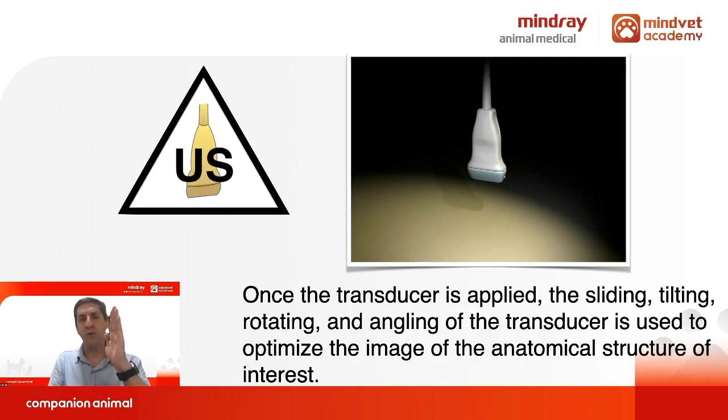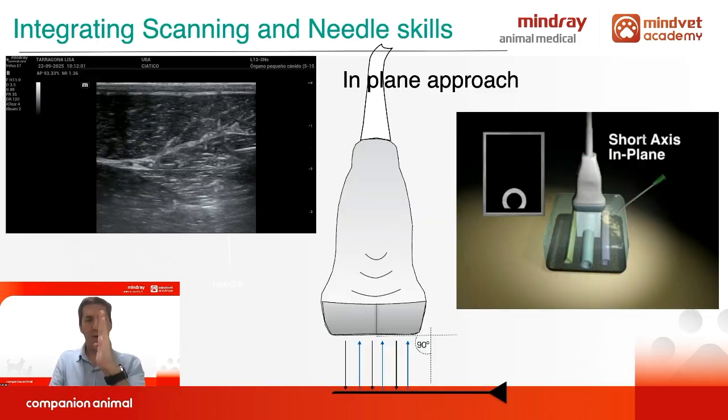But to track the needle, you need to be perpendicular. Okay? This is important. You need to learn to negotiate between a beautiful image and the image that allows you to follow the needle.